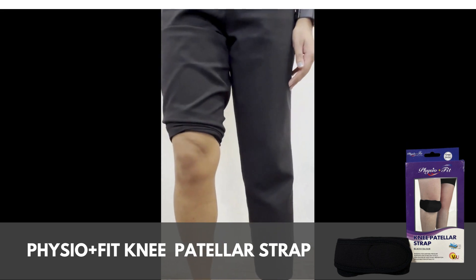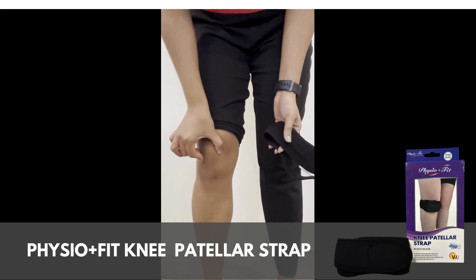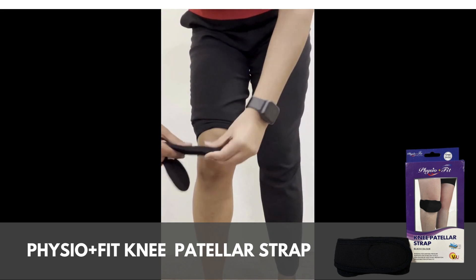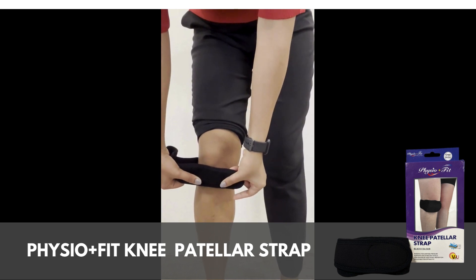Sit or stand in a comfortable position with the knee slightly bent. First, start by palpating the patella, or the kneecap. Just below the patella is the patella tendon. Position the soft padded surface of the strap over this patella tendon.